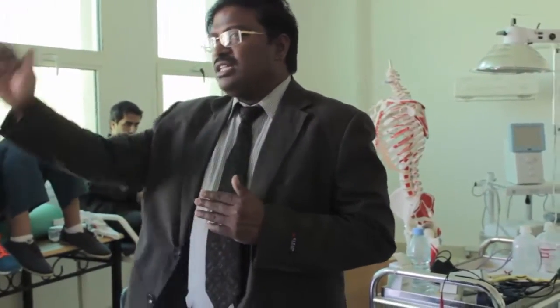You can increase the intensity, you can increase the number of contractions to increase the muscle strength. So you can increase the intensity, that means strength of the muscle contraction, or you can increase the number of muscle contractions. Both of them will increase the strength of the muscles. This is how you will progress regarding the strengthening.